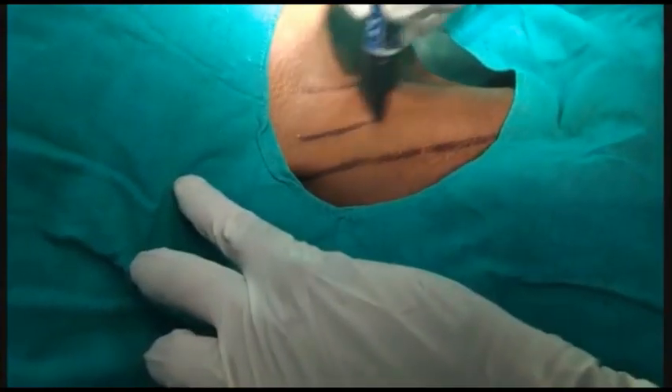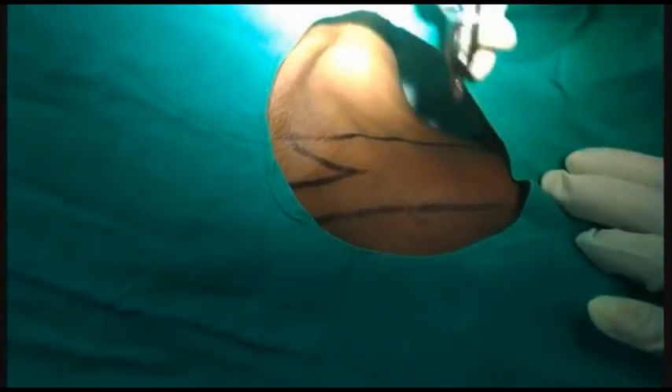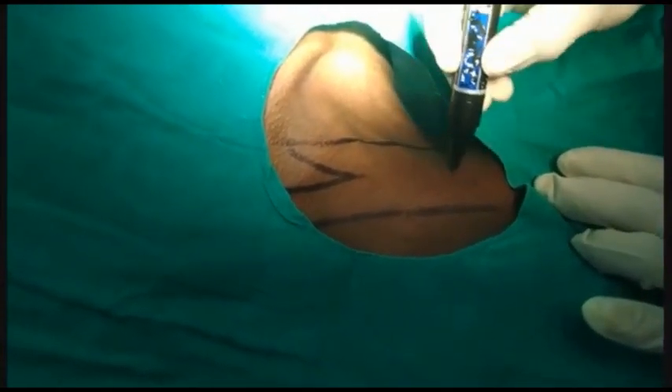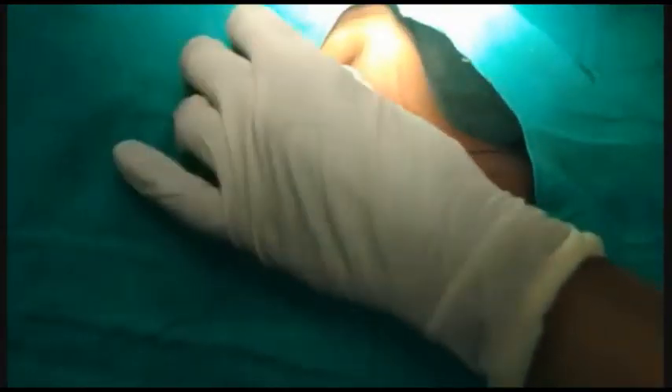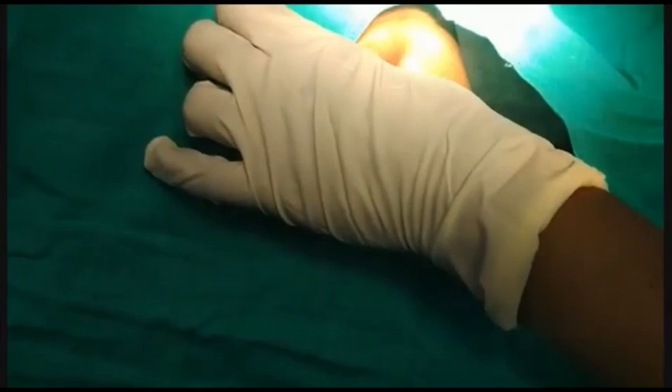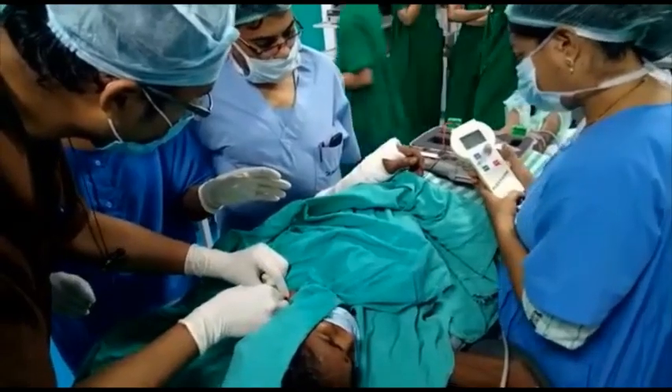This is another video of supraclavicular brachial plexus block. Here we can see the markings of the sternal head and clavicular head of sternocleidomastoid, and this dotted line is the external jugular vein marking. After palpating the subclavian artery, we have to mark this — the round mark is the subclavian artery.